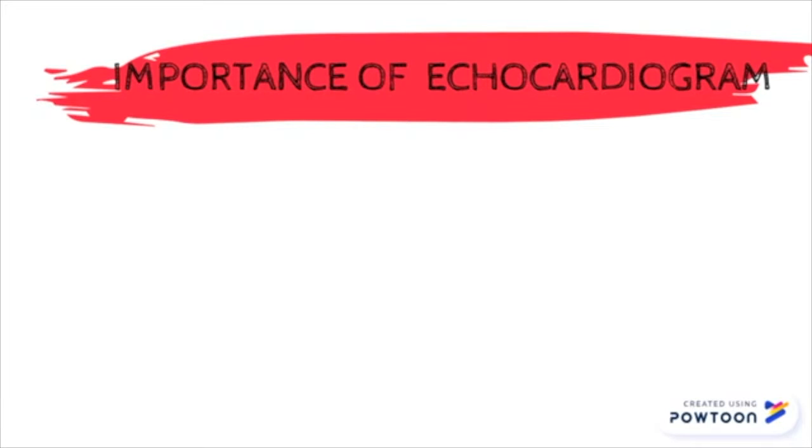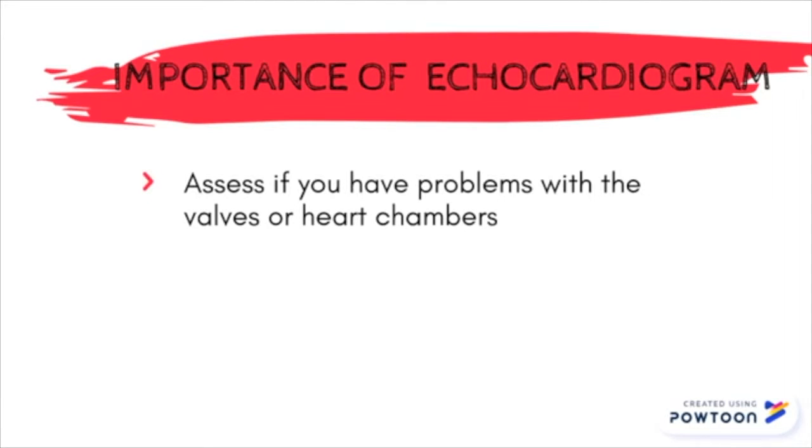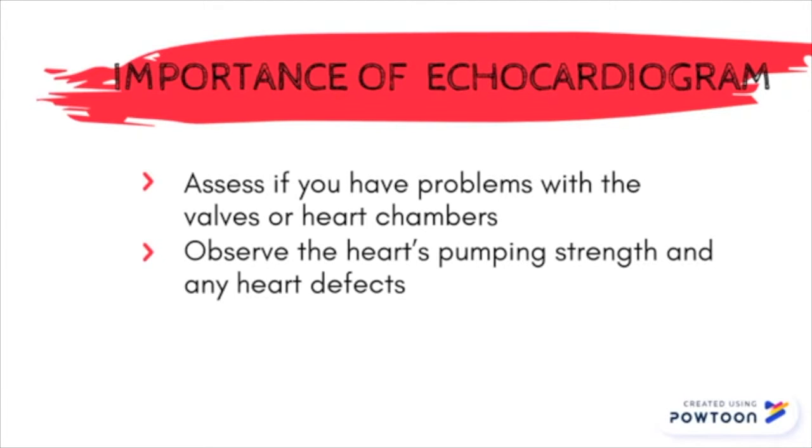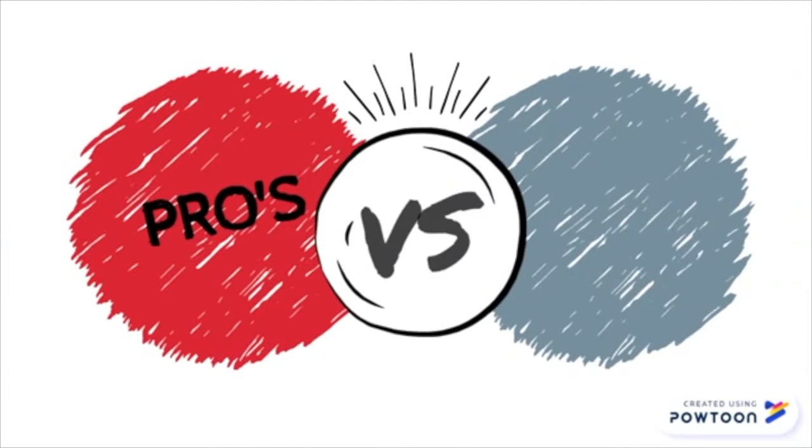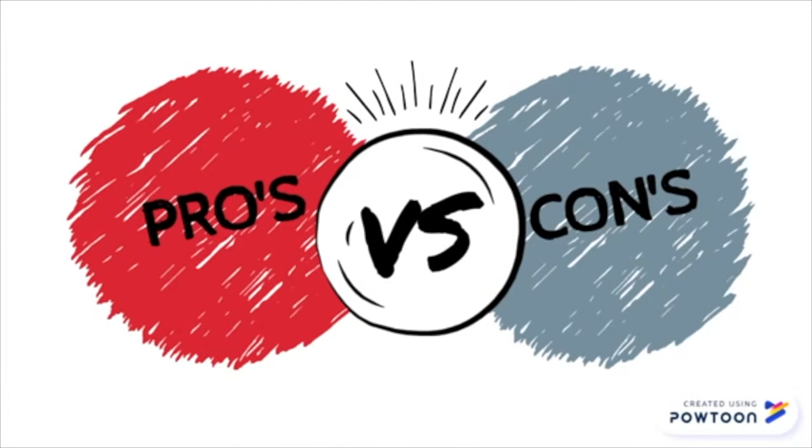Conducting an echocardiogram is important as it helps assess if you have problems with the valves or heart chambers, observe the heart's pumping strength and any heart defects, and help identify any tumor or infectious growth around valves. There are many advantages and disadvantages for the process of cardiac imaging.